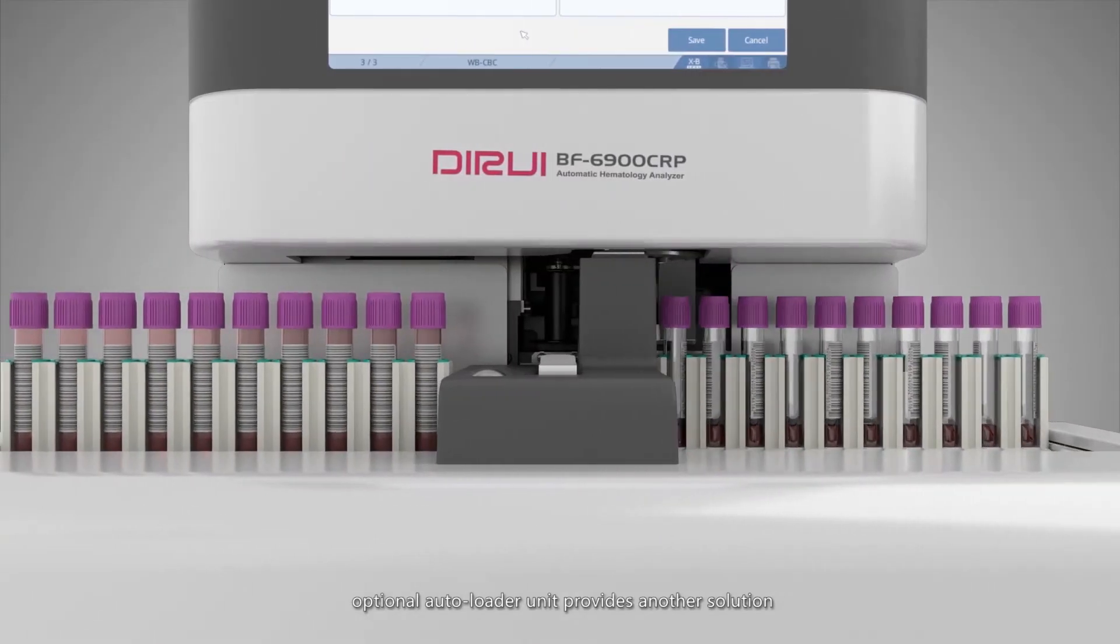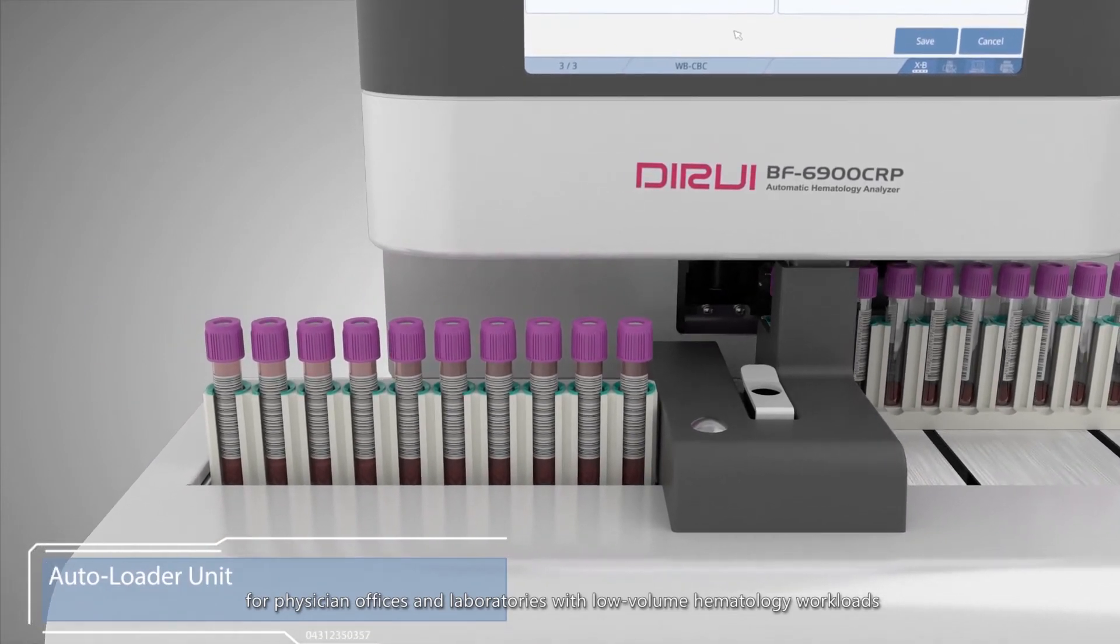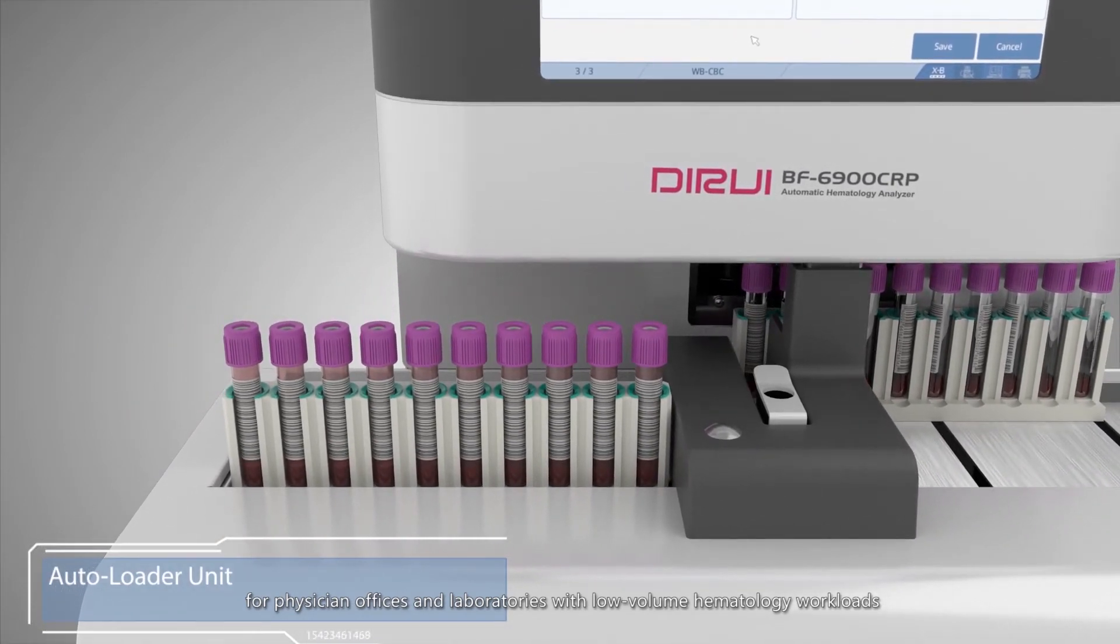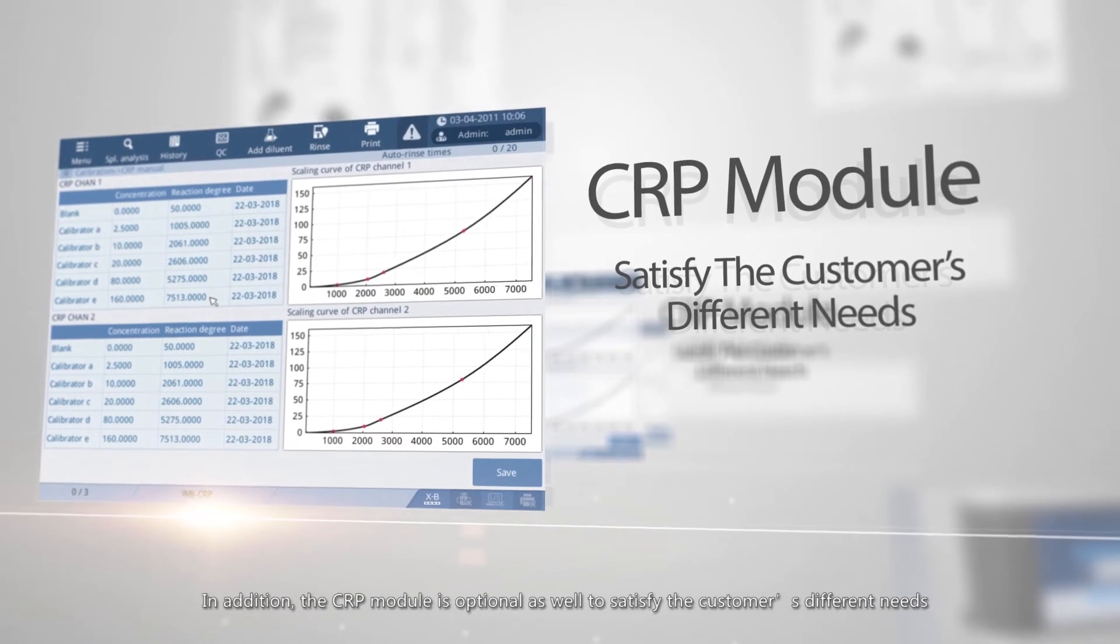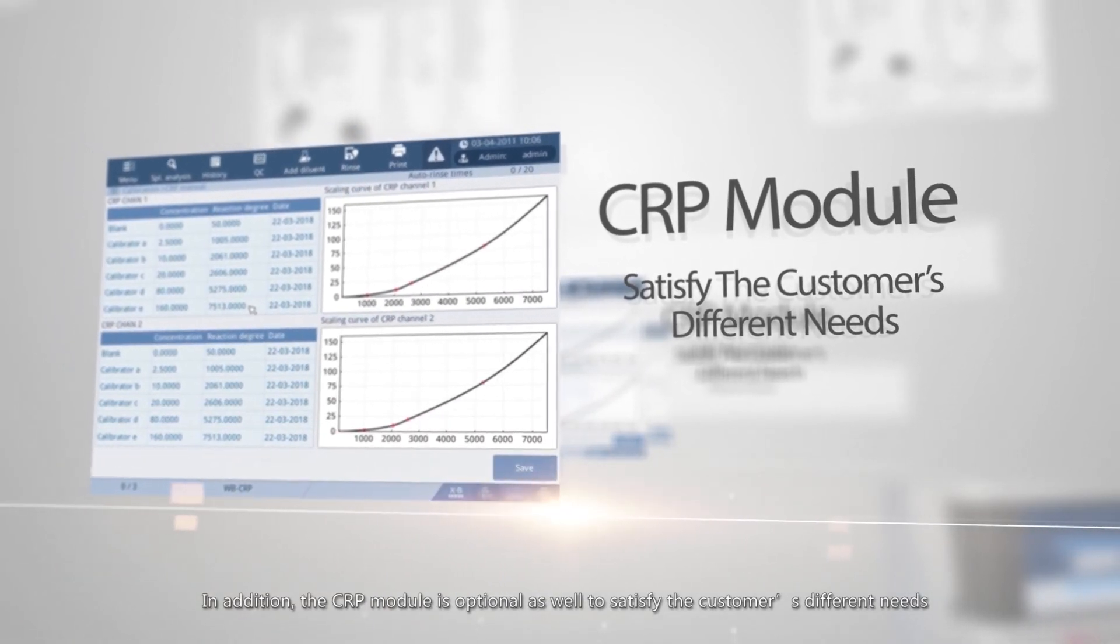Optional autoloader units provide another solution for physician offices and laboratories with low volume hematology workloads. In addition, the CRP module is optional as well to satisfy the customer's different needs.